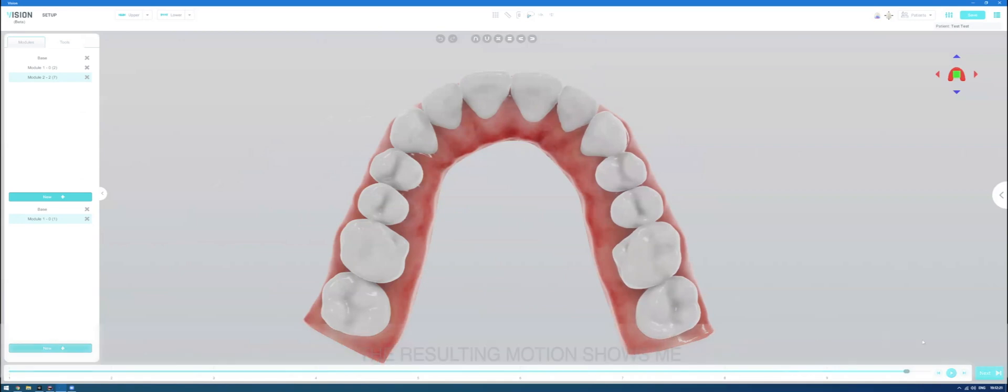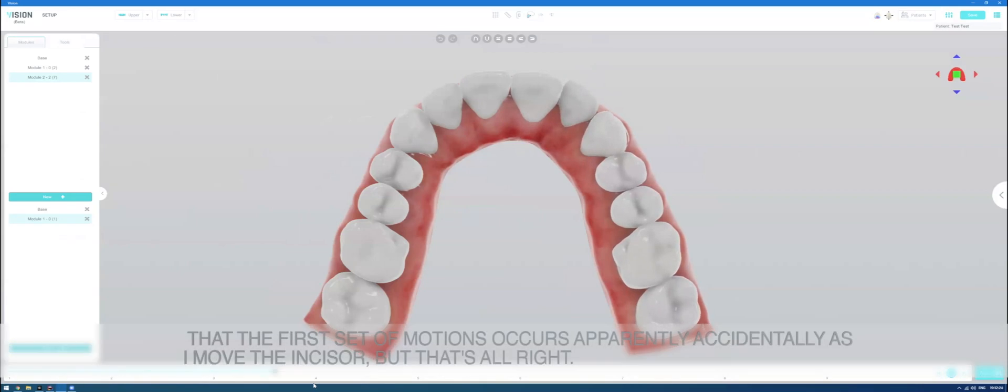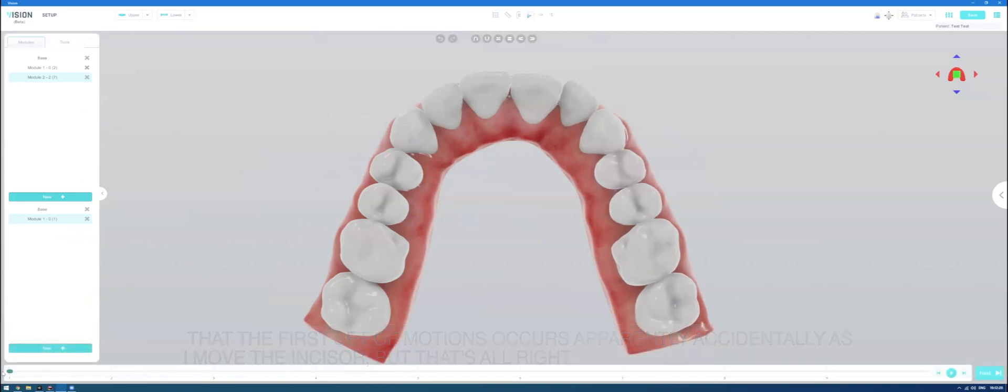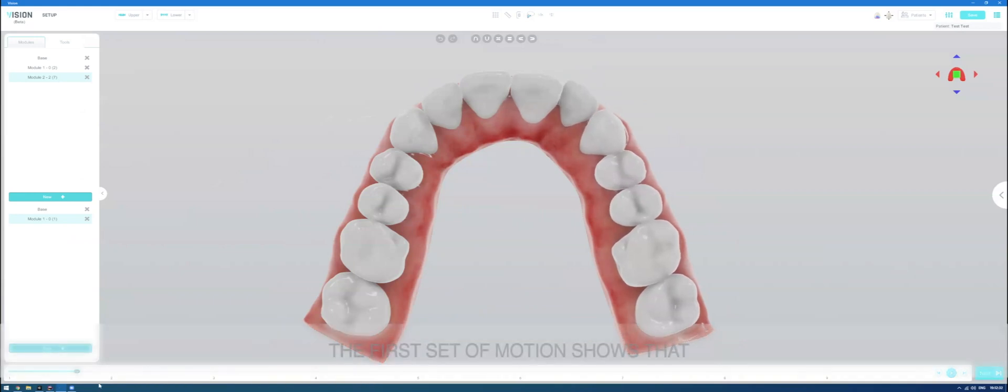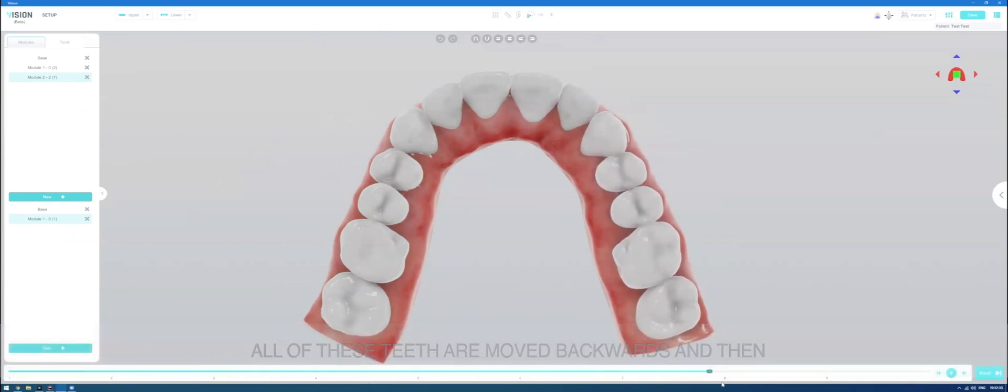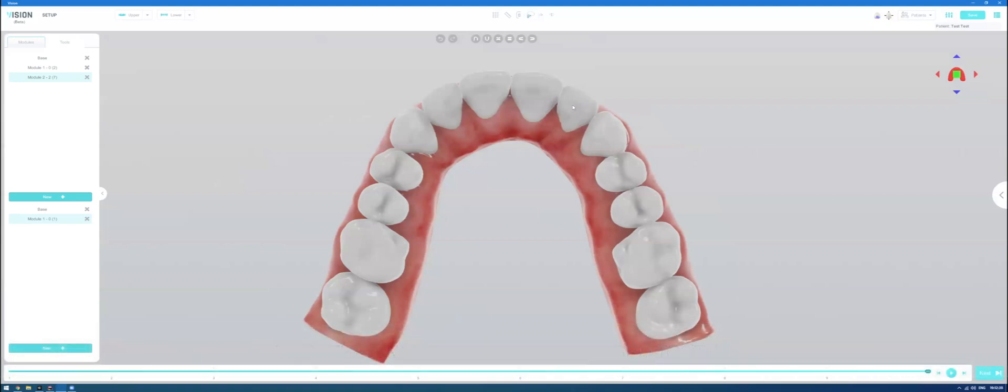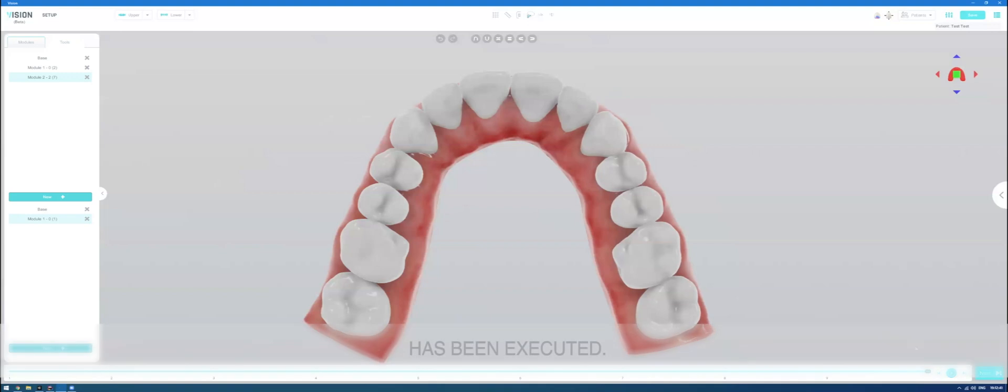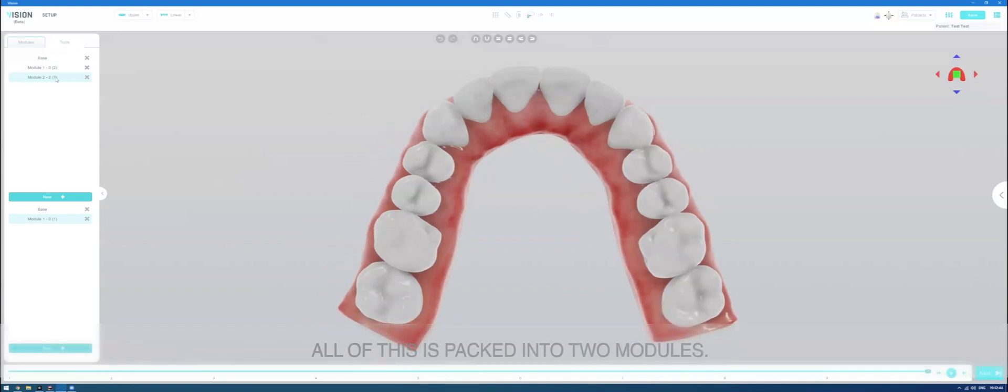The resulting motion shows me that the first set of motions occurs. I apparently accidentally also moved the incisor, but that's all right. The first set of motions shows that all of these teeth are moved backwards and then the final motion of the desired tooth has been executed. All of this is packed into two modules.